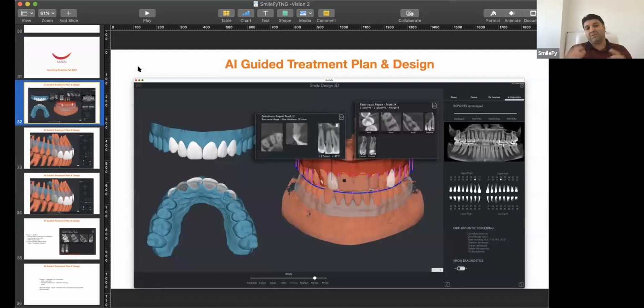So what is the biggest problem that we have right now? We have a solution for AI diagnostics. We have a solution for smile design. We have a solution for X-ray diagnostics. We have a medical viewer on a different computer. We have solutions everywhere. We have computers and we have solutions. But we need everything linked to the workflow of smile design. Otherwise, we're not going to use all these solutions and they are useless for us.